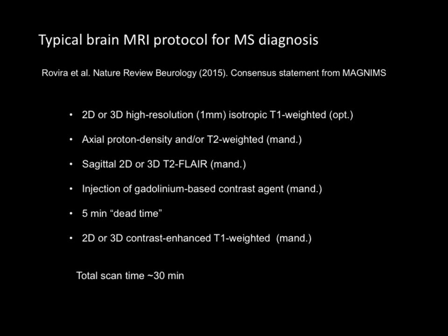Now, if you look at the typical MRI protocol that is run in the clinic, wherever you go in the private center or the hospital, it's usually very short. You have about 30 minutes, then you have to bring the next patient, bam, bam, bam. Nothing compared to what we do at NIH, where we scan for an hour and a half. The hospital setting is much more stressful.